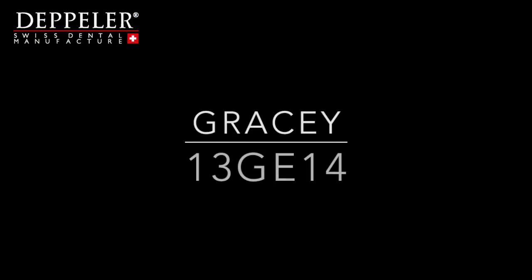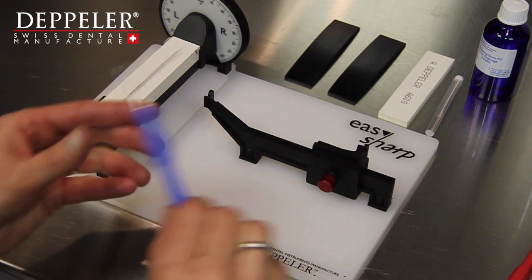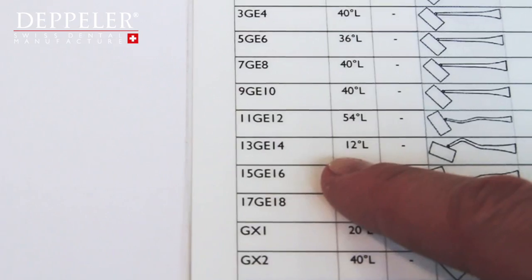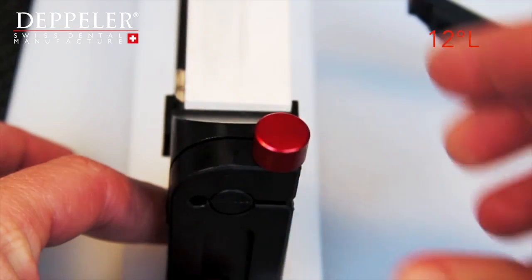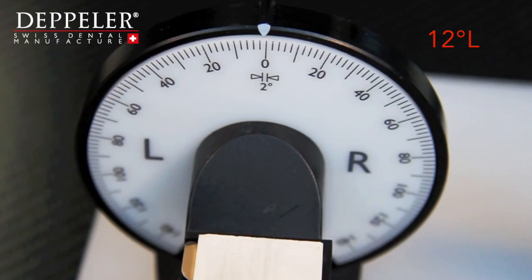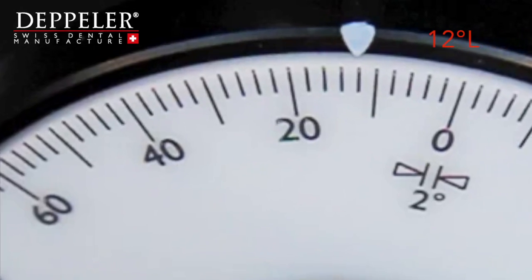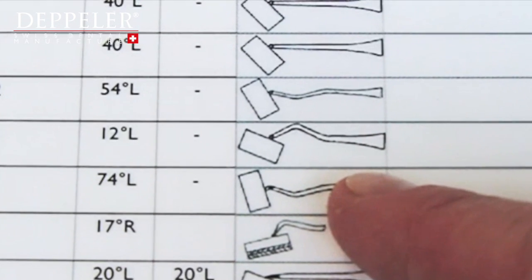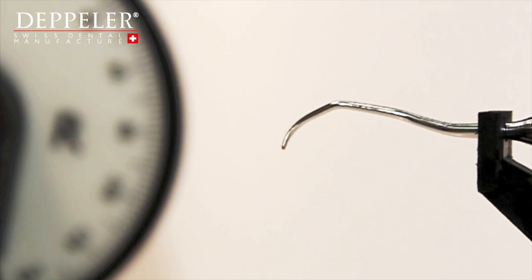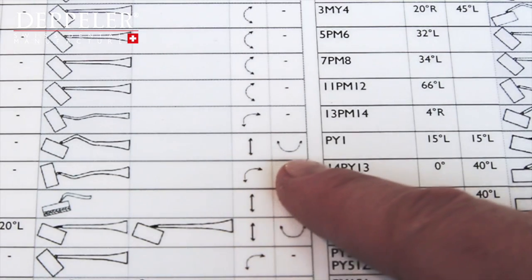Repeat the operation with the Gracey 13-14 curette. Fix the instrument. Adjust the angle. Refer to the drawing that shows the instrument's positioning on the stone. Check the movements of the stone and those of the instrument.